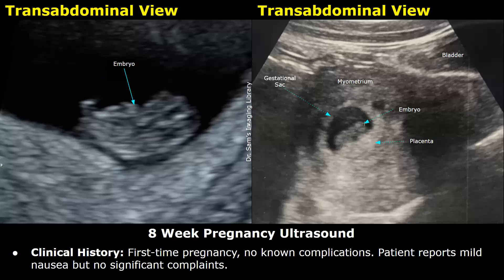These are transabdominal images. We can see the gestational sac and the embryo within the sac. This is the myometrium of the uterus, and over here is the bladder. This is in the longitudinal plane.